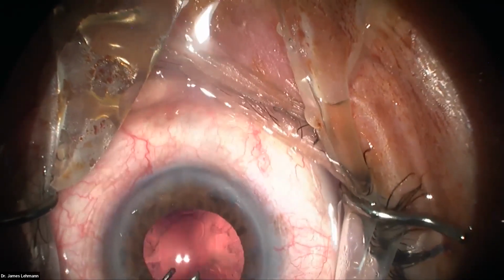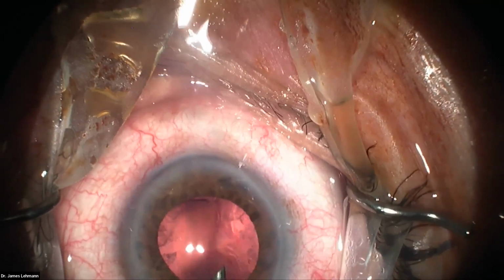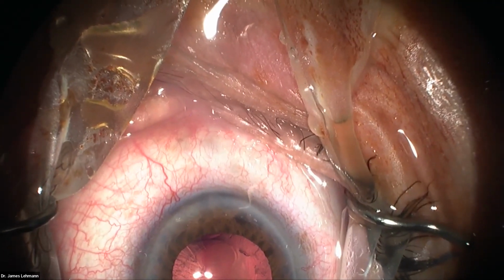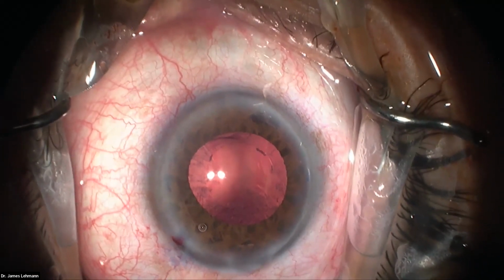But now you can see we've gotten the cataract, gray red reflex, and just minimal cortex. So I'm going to remove this, turn off the continuous irrigation, and now we're going to put the I/A on just for those last little cortical fragments there, little cortical debris.